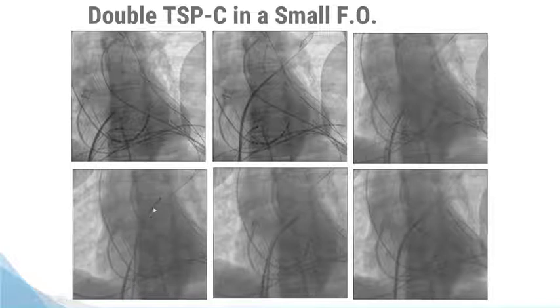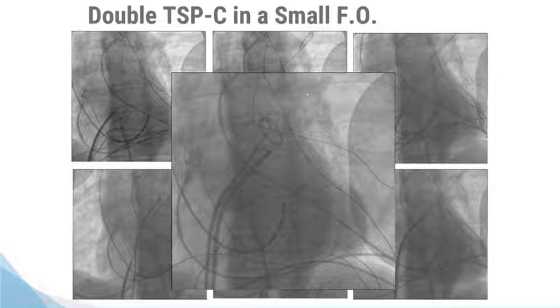We advance the catheter across the first puncture in the left atrium, then we advance the second transseptal sheath over the second catheter, and then again we advance the first transseptal sheath over the guide wire so that we can safely bring the second catheter, the lasso catheter, and the ablation catheter in the left atrium.